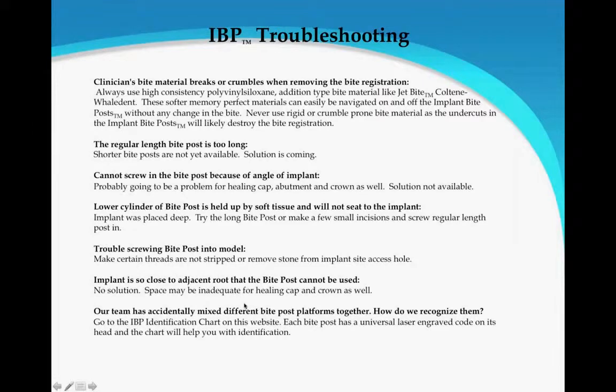And a big one is our team has accidentally mixed different bite post platforms together. So how do we recognize them? Again, go to the IBP identification chart. It's on the website. Very easy to do.